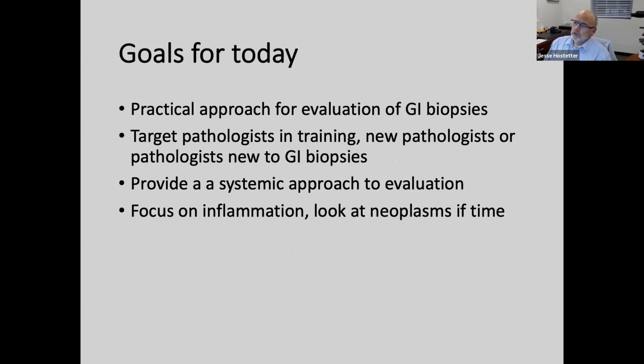Our goal for today is to provide you with some strategies for evaluating GI biopsies. The audience I'm really trying to target with this talk is pathologists in training, pathologists just out of their training programs, and pathologists that are new or maybe just frustrated with reading GI biopsies.